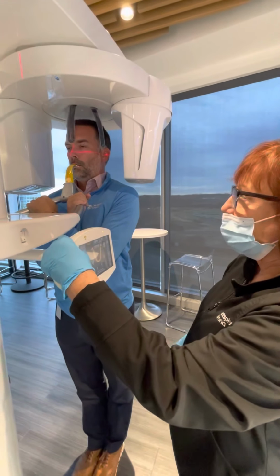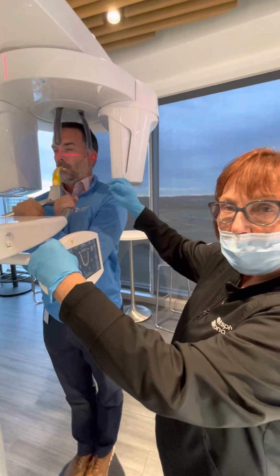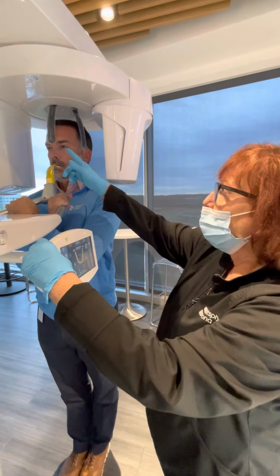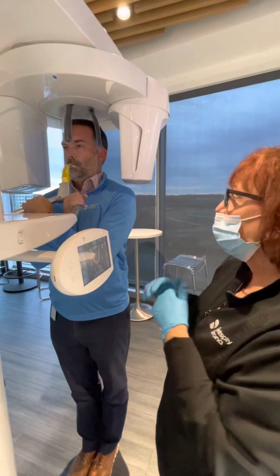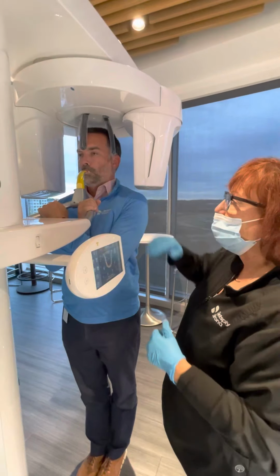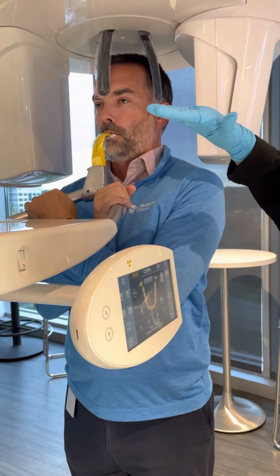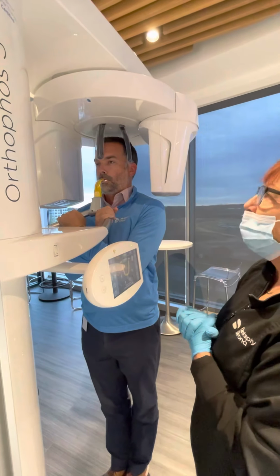Then the next step is to close the temple supports until the motor stops completely. And then I will very gently touch the forehead support just to give him something to lean against. Then we go straight to verbiage, which is to close your lips and swallow. Hold your tongue to the roof of the mouth during the whole scan, and do not move until I walk back in. And that's it.